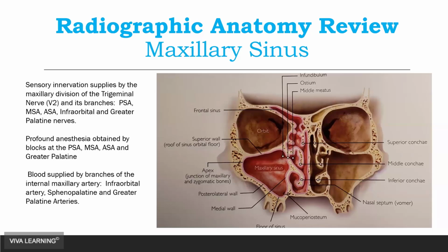So it was the second course I took after my intro to implant course, something about vertical sinus lifts. So it's very important that we become very comfortable with the maxillary sinus. What you see here in the middle near the nose is at the middle meatus in the middle concha, that is where our sinus drains. So it's actually quite high.